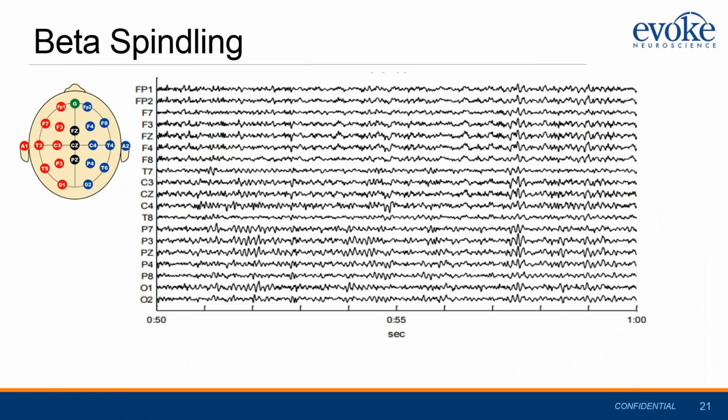Now, typically this excess beta phenotype comes with what we call beta spindling. So beta spindling you can pull out of raw EEG data, and we're looking for really dense cycles, and that's our beta, right? Remember, beta is fast cycles, fast, really dense, dark cycles, lots of cycles per second. So we're looking for these little dark squiggle lines. That's called beta spindling.